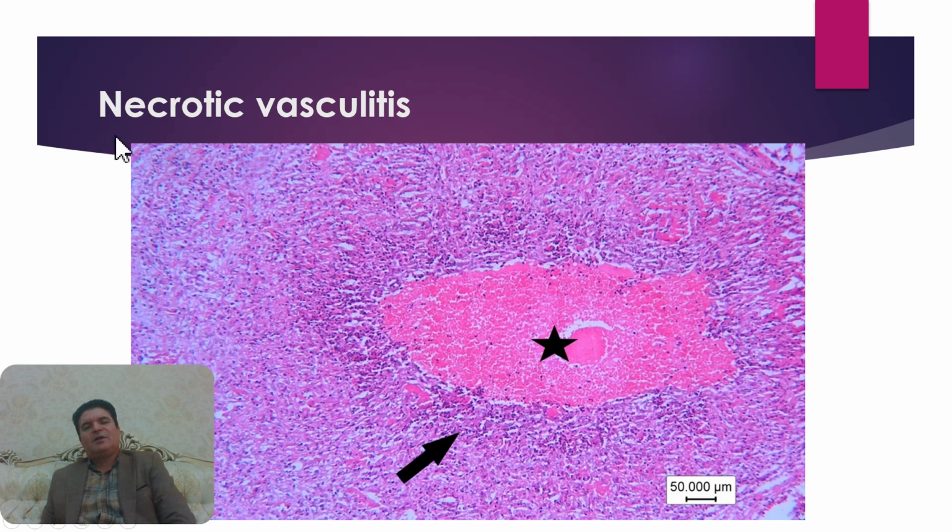As you can observe here, I called it necrotic vasculitis due to fungi infection.